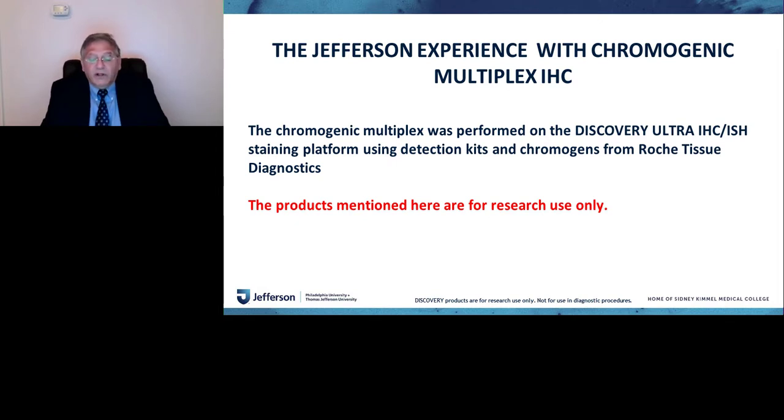Basically, what we have done is develop chromogenic multiplex assays on the Discovery Ultra IHC staining platform, using detection kits and chromogens from Roche Tissue Diagnostics. Again, this is for research only, but I think this is something that may have, and I believe they will have, some clinical use in the future.